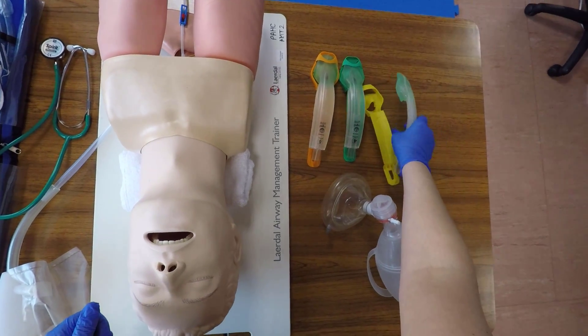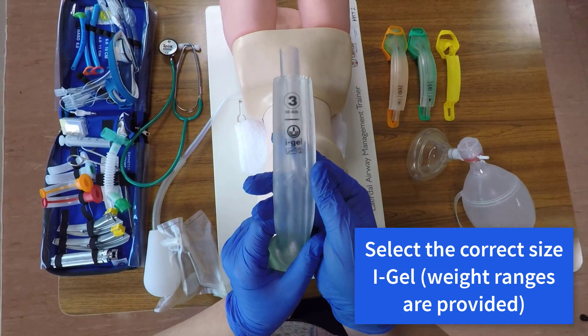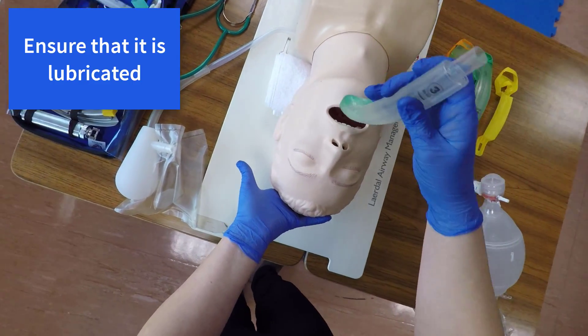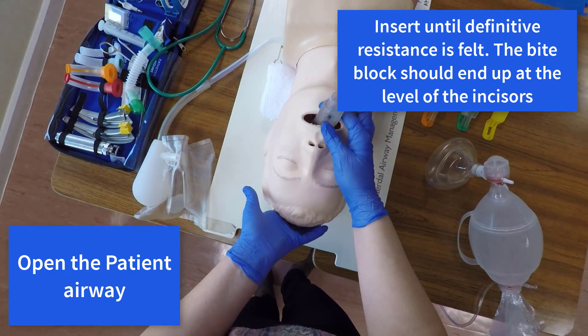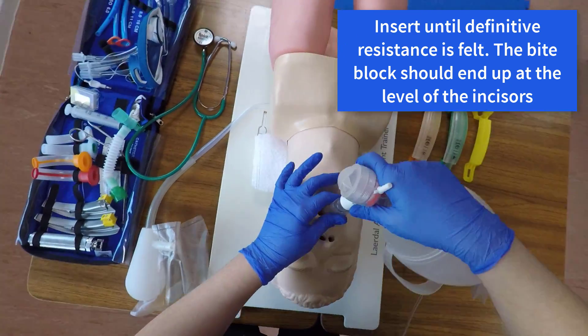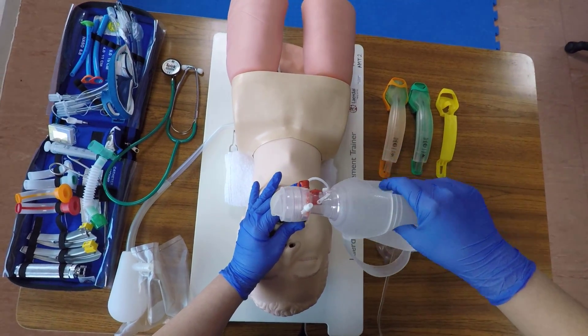Select the correct size iGel. The weight ranges are provided on the iGels themselves. As a guide, a size 3 is for a small adult, 4 for a medium adult, or 5 for a large adult. Place a small amount of lubricant on the inner and outer rim of the device. Open the patient's airway and insert the iGel until definitive resistance is felt.